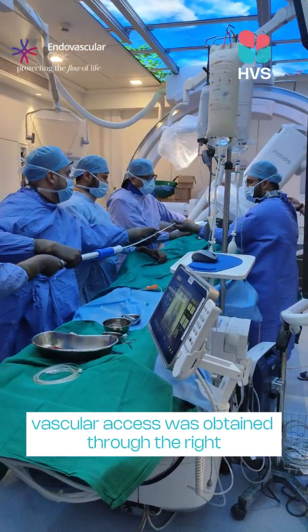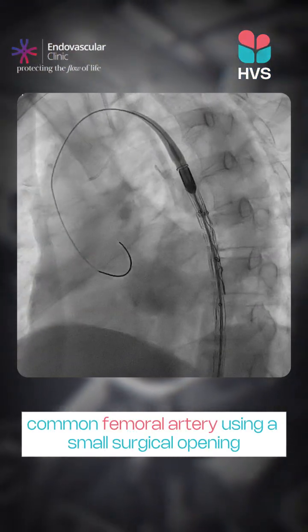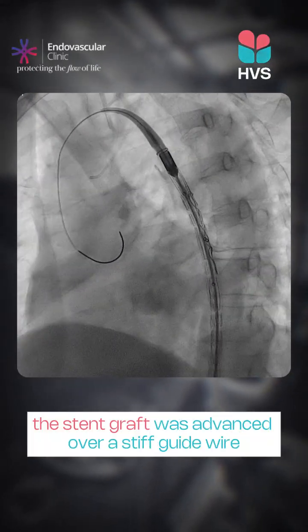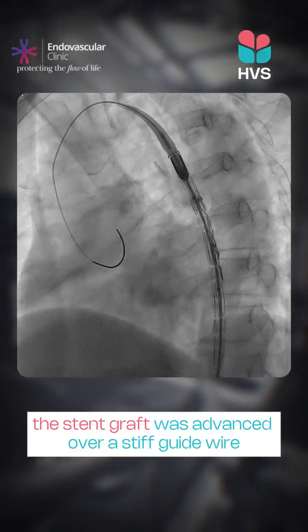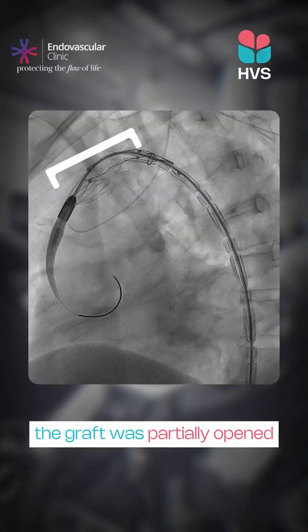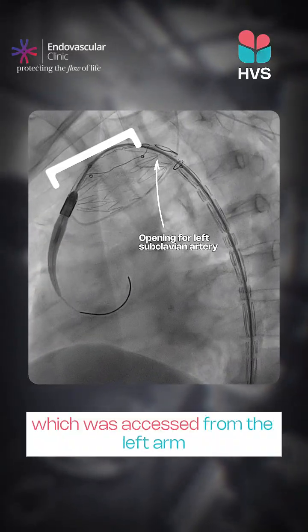Vascular access was obtained through the right common femoral artery using a small surgical opening, along with access from the left arm via the brachial artery. The stent graft was advanced over a stiff guide wire, and an aortogram was performed to confirm correct positioning. The graft was partially opened to expose the fenestration, which was accessed from the left arm.